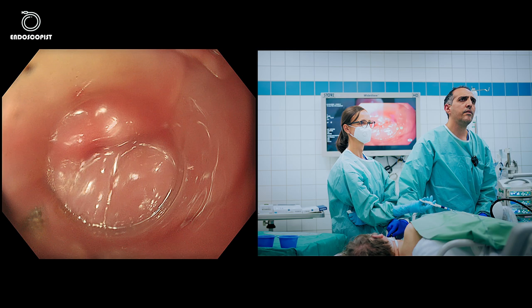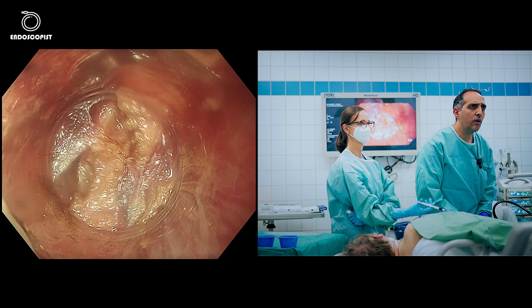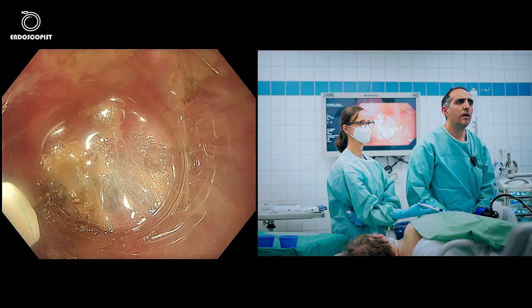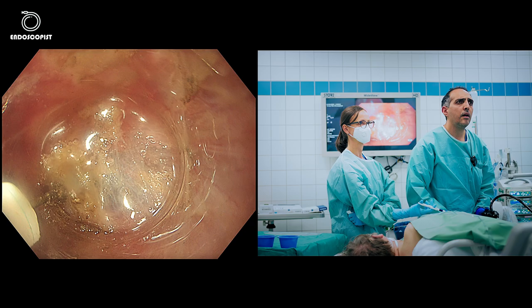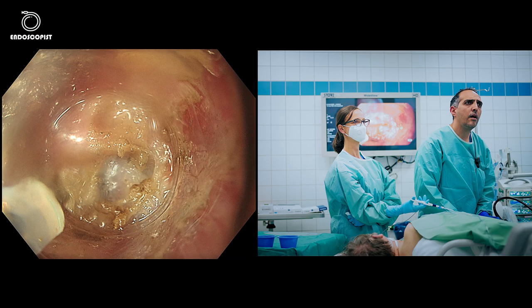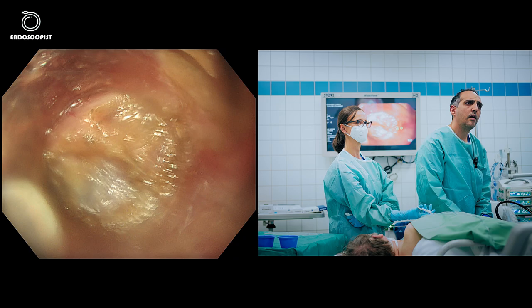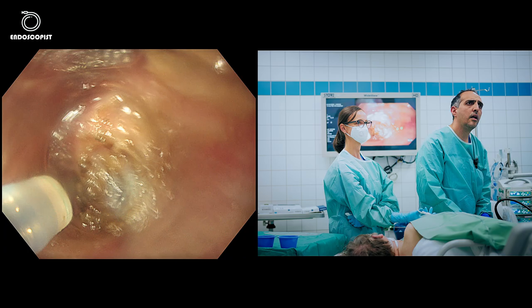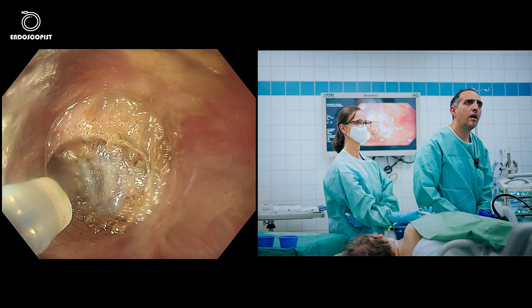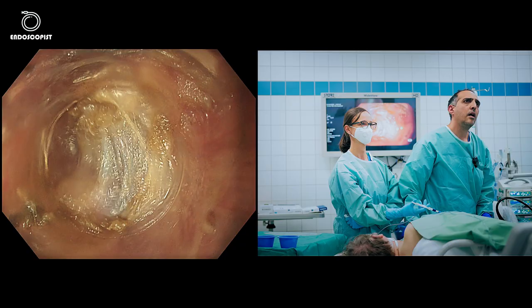I think we're finished. I'll go again inside the tunnel to check for any remnant muscle fibers and make a small additional cut. We are at the end. I am totally satisfied. You can't reach this depth of cutting or myotomy using standard septotomy — and this is the beauty of Z-POEM.